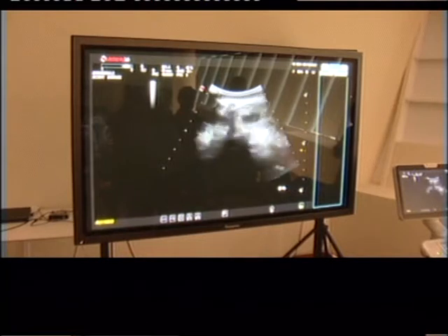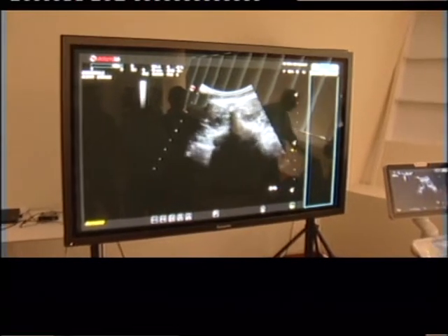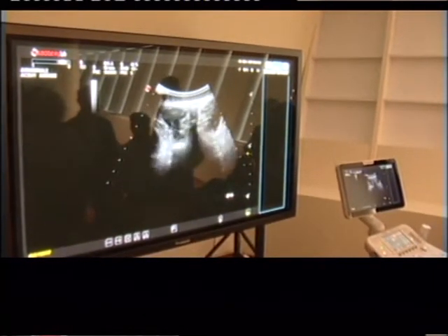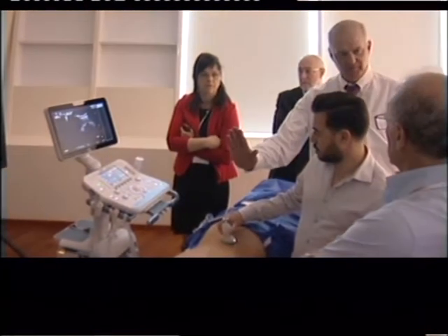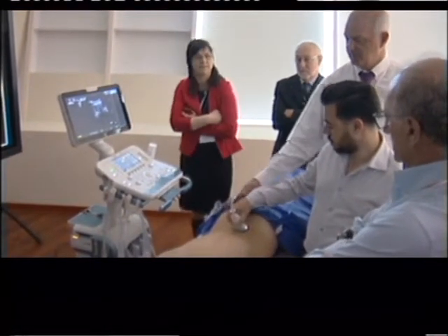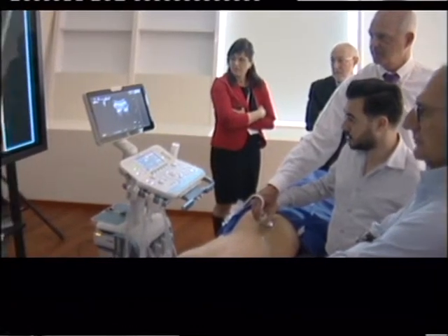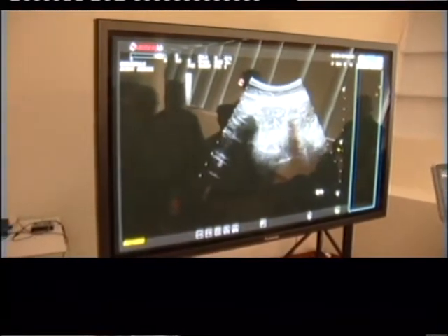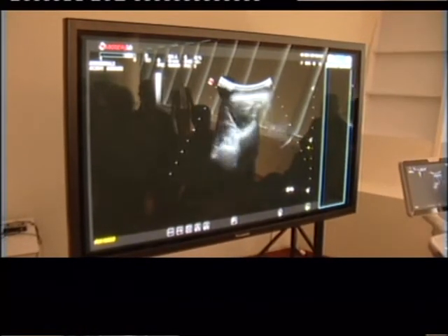Okay, so S1. Remember, L3 is straight down, but you're not straight down till L3, so it has to be 4, 5. If you're counting, if you've got sacrum, you've got to be about 45 degrees. So there's 1. That's one. And now there's 5. Not too much. In other words, you have 3.